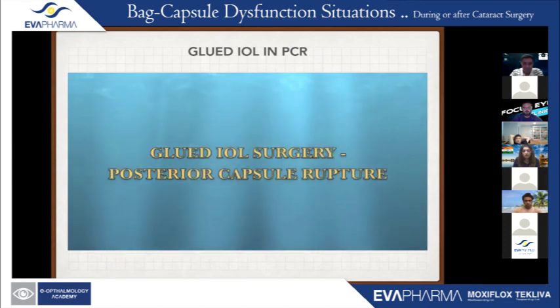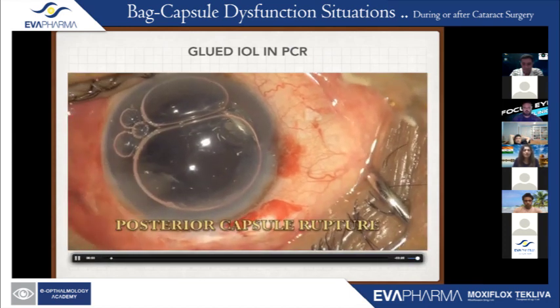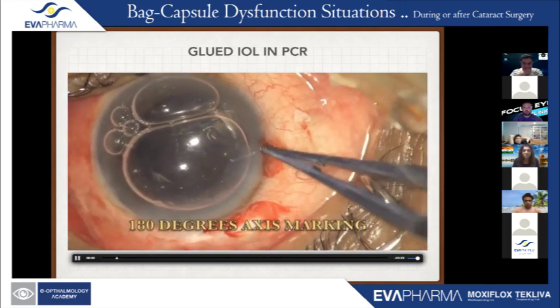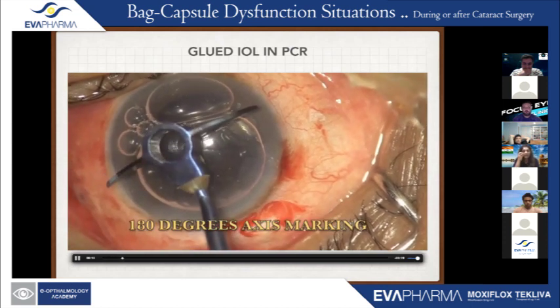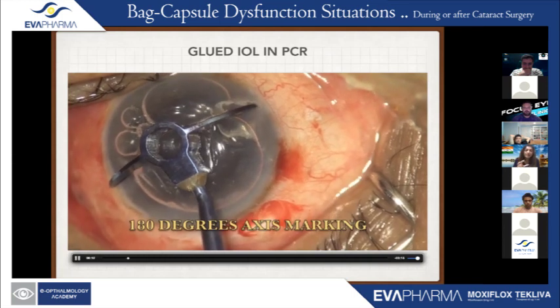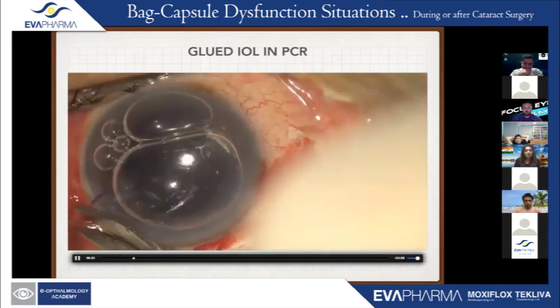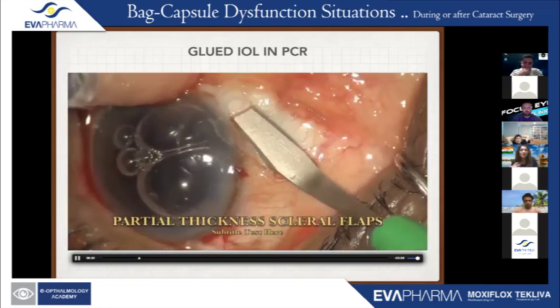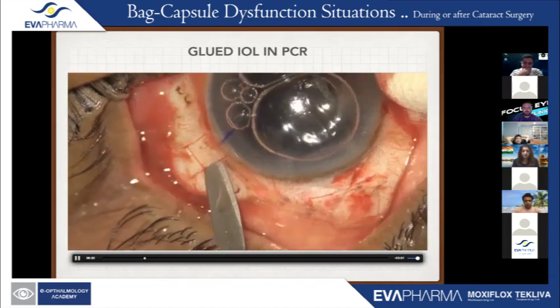Now I'm going to show you a very simple case. This is a case of aphakia. I'm not showing anything great here, just the basic technique. This is a referred case, and what you can see is the air bubble inside the anterior chamber. The best part was that the referring surgeon had made all the incisions taut, and had also done a little vitrectomy in the anterior chamber, so that no vitreous was coming out from the corneal incision of the phacosurgery.